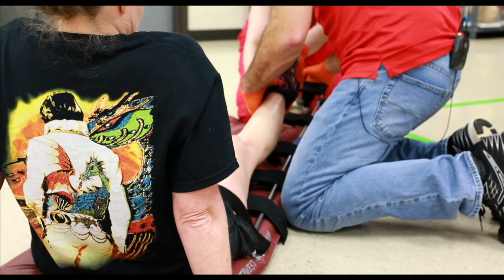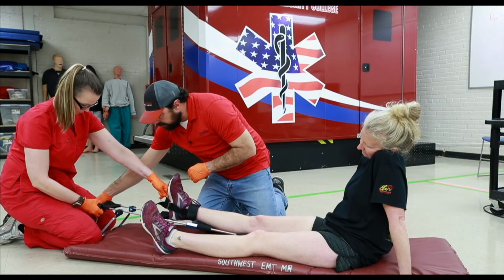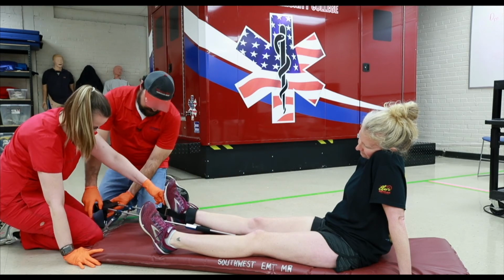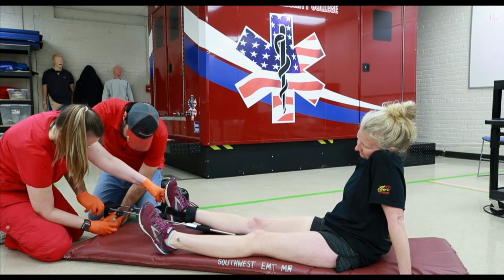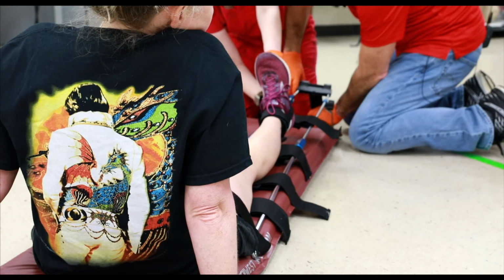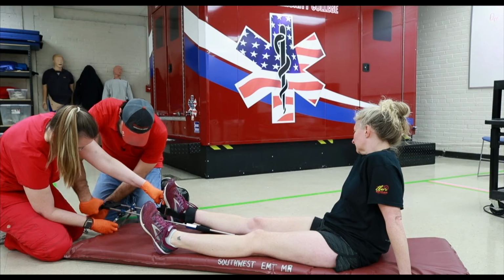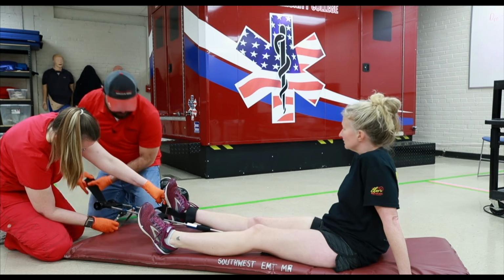Now you can connect this part. You're going to have to probably let out a little bit and pull and turn. There you go. Sometimes it is tricky. I'm not kidding. You got to pull and turn. There could be easier releases out there for some. It would make it too easy for video purposes if this one was one of those. So you got to pull and turn at the same time. That way I start sweating. That looks really good for the camera.